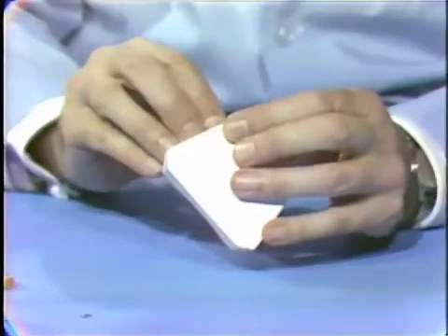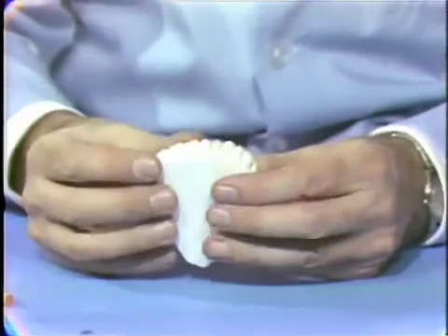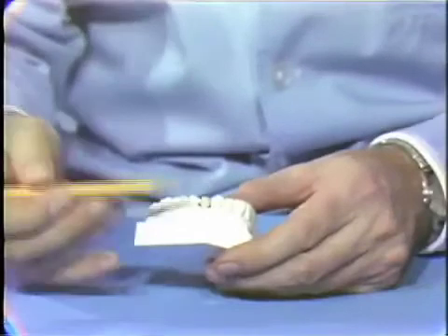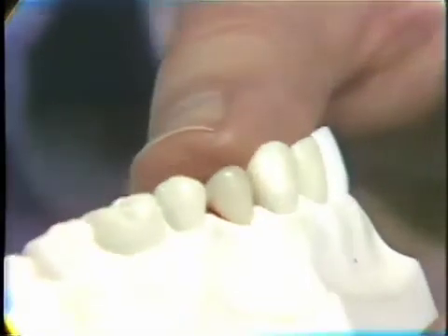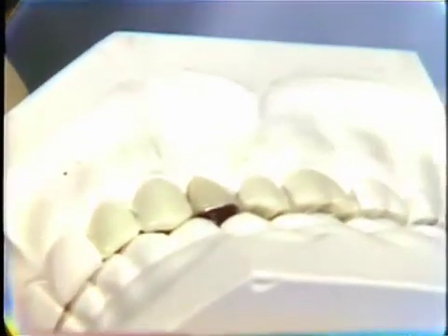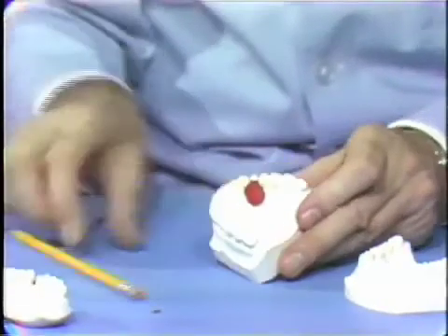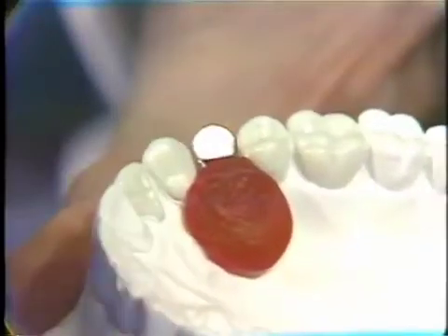It's a good point at which to try the facing back onto the original model and check the adaptation to the mucosal area, check the vertical length, check the opening of the embrasures here, and make sure that there's adequate space on the occlusal surface for the wax up, and also check the relationship to the adjacent teeth, so far as connectors are concerned, to the retainer on that tooth and the one on this.